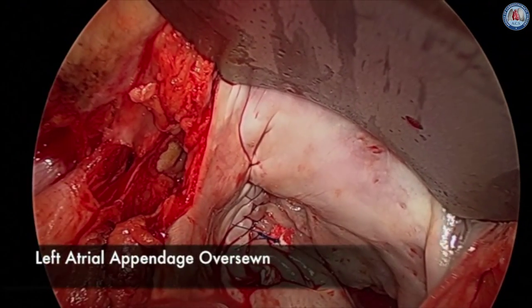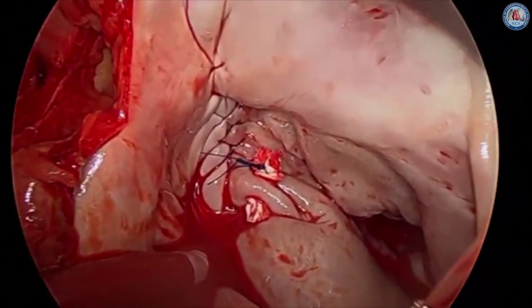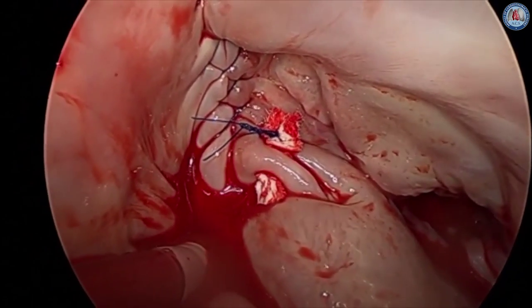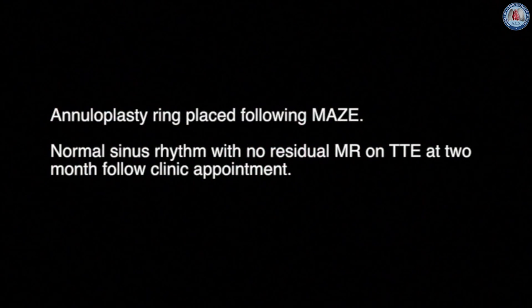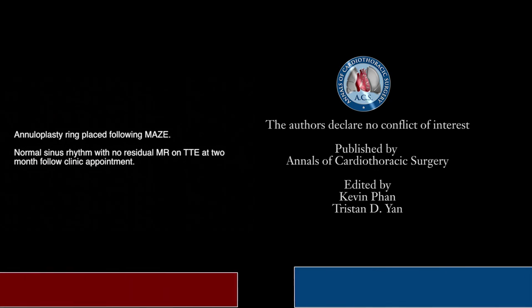At the end of the case, the atrial appendage is oversewn in two layers using a running 4-O proline suture. The mitral valve repair is then performed. This patient recovered without complications.